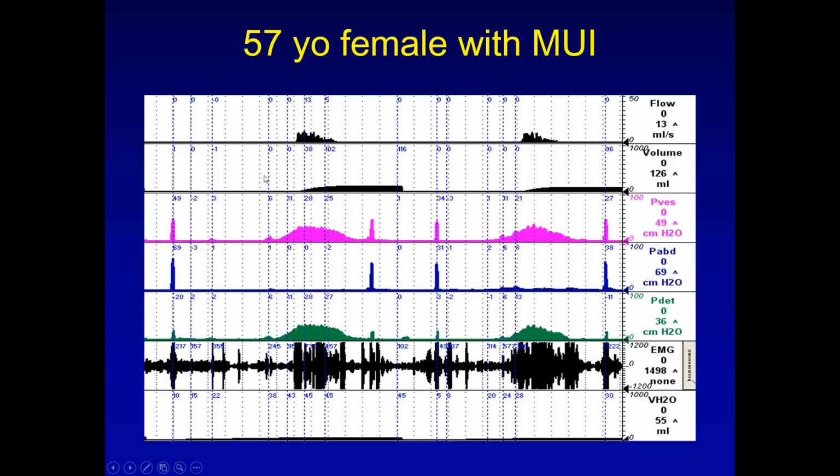Fill volumes. And then on the top, you've got the uroflow and the voided volume. What you're looking at here is two studies superimposed or running one after another. On the first run, we got her up to 45 cc's or 43 cc's. Her first sensation was 22, which was very early.